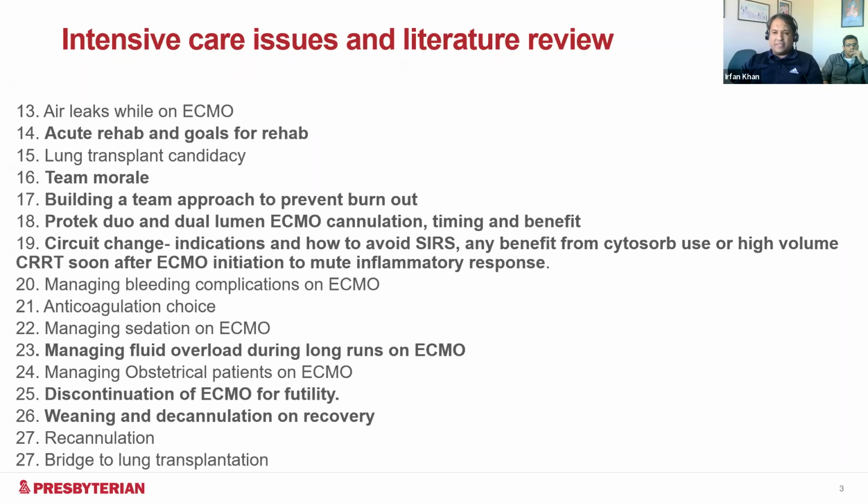Managing sedation on ECMO, huge problem, because these patients want to move. You want to make sure the cannulas don't move and the patient remains supported. The obvious complication of not sedating them adequately is that these patients get decannulated accidentally, and that can be a problem. So what is the optimal sedation, and how do we minimize the need for sedation? That's something that's been a huge challenge. The way we have dealt with it is to obviously extubate these patients over time, and then essentially offer a tracheostomy later on in the course.